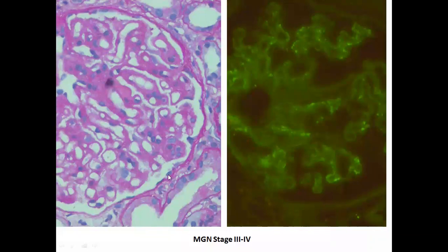A higher magnification, just for comparison again, that sometimes the membrane thickening is so significant. If it is a very advanced membranous, just compare this tubular basement membrane again with this glomerular capillary wall thickness. This glomerular capillary wall thickness is like 2 to 3 times the thickness of the tubular basement membrane. That means it is a very advanced membranous.